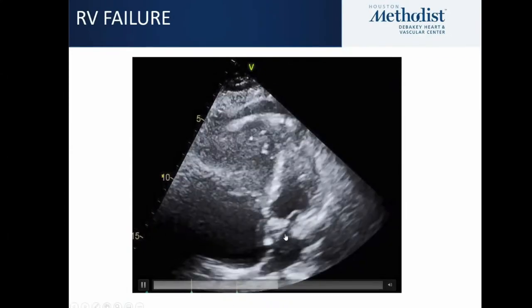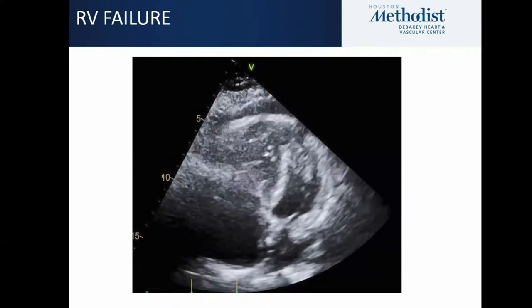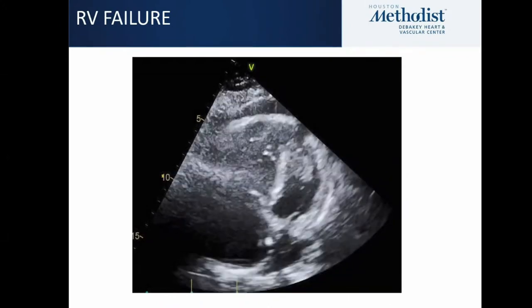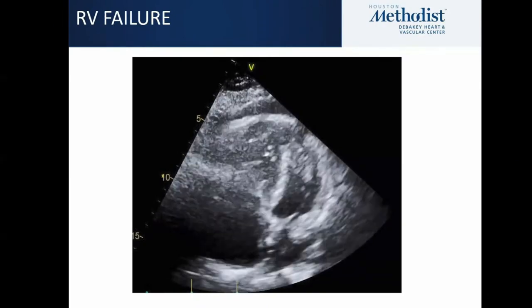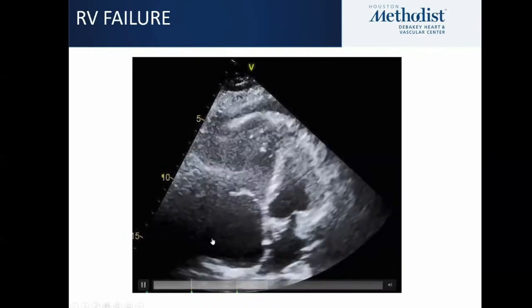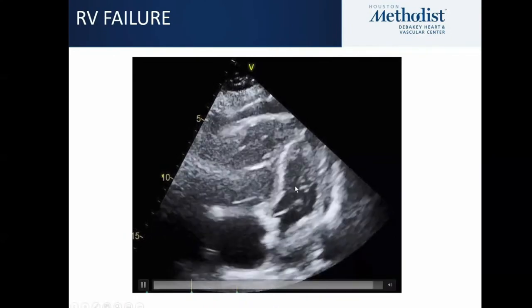Of course, this is, again, a clinical diagnosis. At the bedside, we saw that the patient's CVP jumped up to 25 with a cardiac index that dropped to 0.9 despite being on 4,800 RPMs on the HeartMate 3 LVAD. So this is one of a kind capture on echo. As you can see, the RV is humongous and there is profound RV failure.